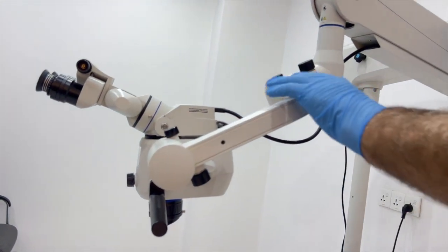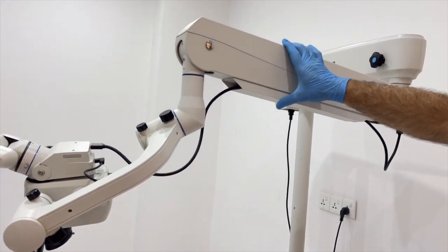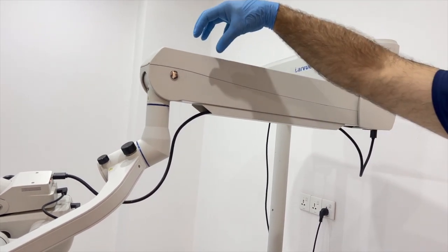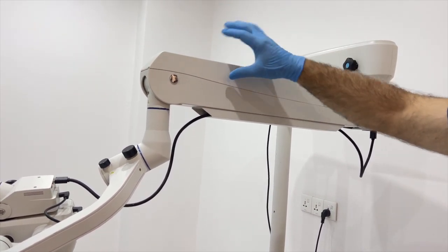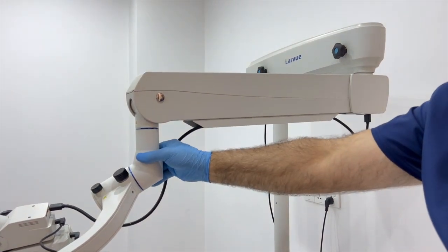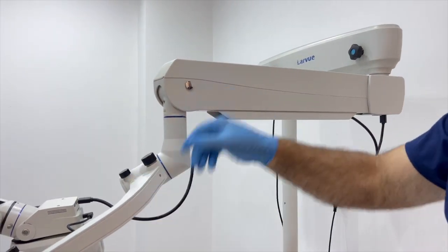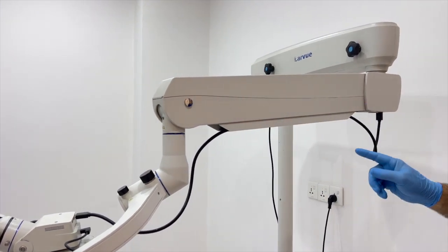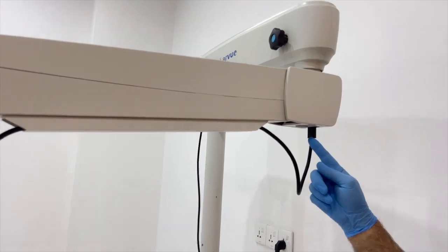Finally, we have the secondary arm movement. So the microscope, when we are loosening the screw, this arm should be balanced. Okay, so if the dentist wants the microscope to stop in this position, it should be stable. And we have this screw.